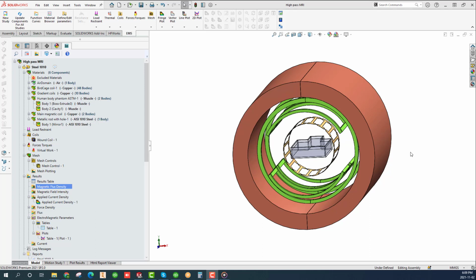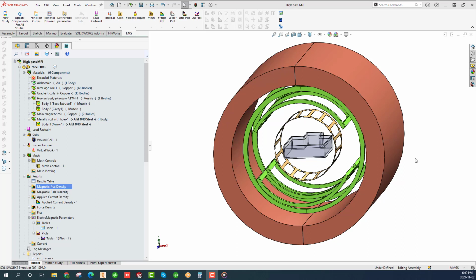However, it has another big limitation. It interacts with metals in two distinct ways. The first is related to the external large static field which generates a magnetic force on ferromagnetic materials. The second interaction with the metals is caused by the varying RF waves used in the MRI machines.